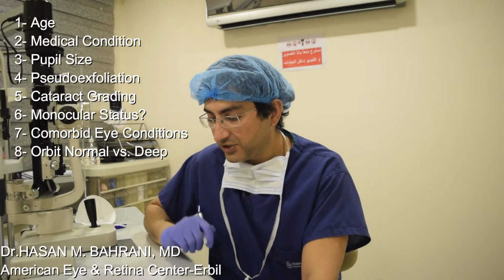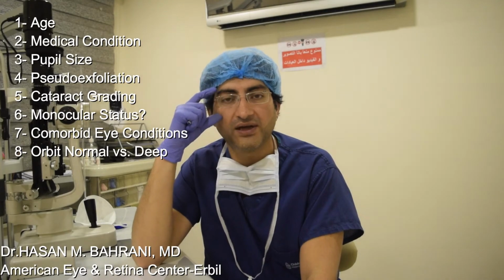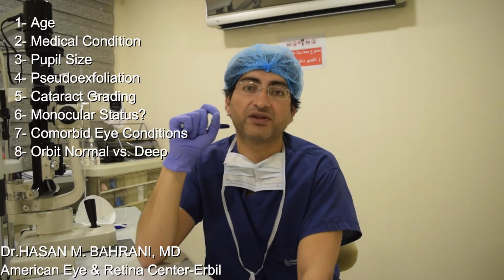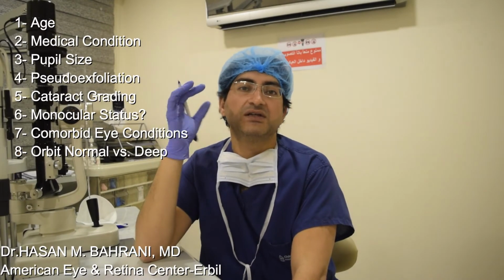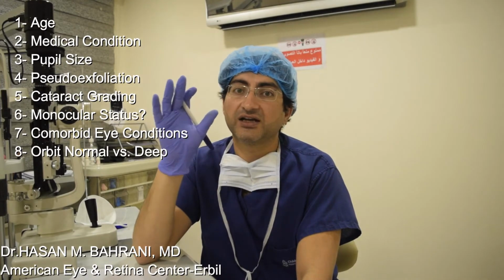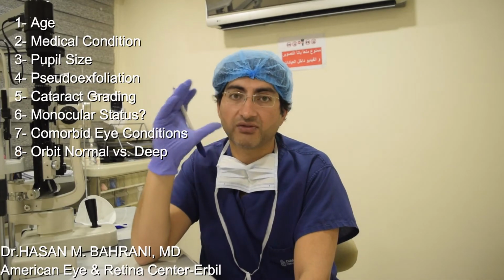One additional thing I forgot to mention: the globe and the orbital rim. This is very important. The nose and the orbital rim are extremely important things to note in your assessment, because for patients who have a high orbital rim, ridge, or nose, you need to start thinking about some type of positioning.